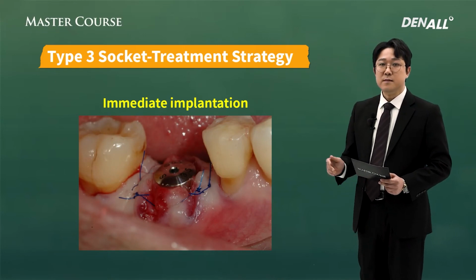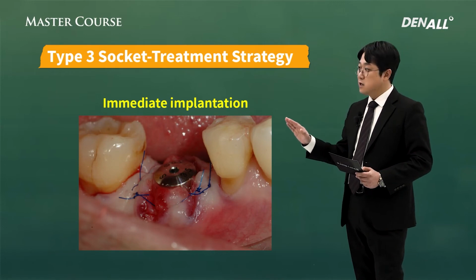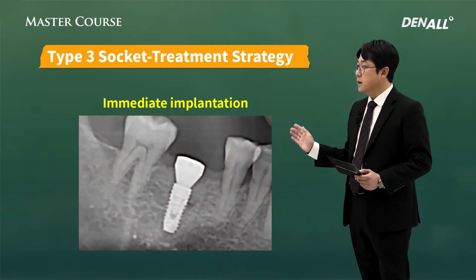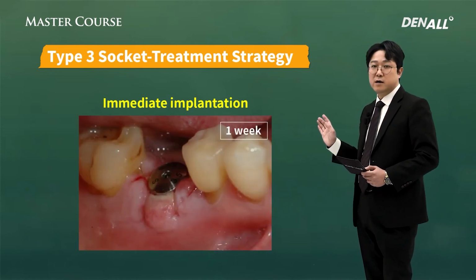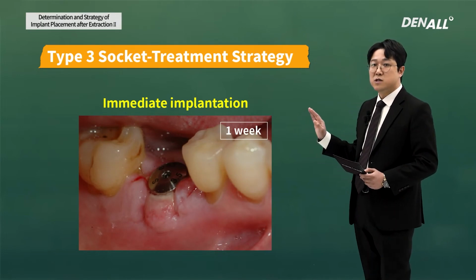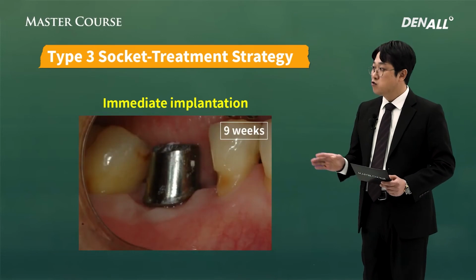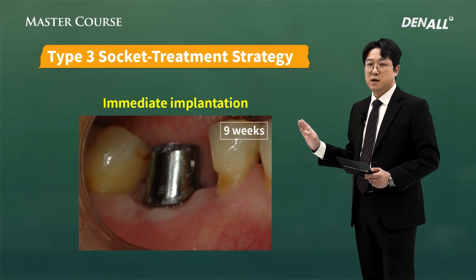This is after suture. The epithelialized granulation tissue in the socket replaces the buccal gingival loss. X-ray image after surgery, 1 week later, and when suture was removed. The epithelialized granulation tissue will later heal into a keratinized tissue. 9 weeks later, abutment was connected.